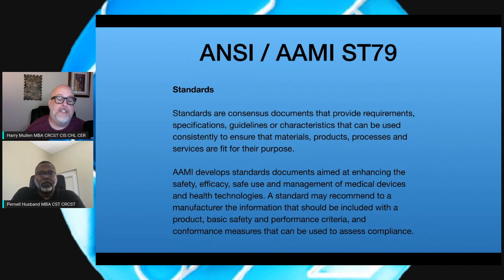Yeah. And as it says here also, AAMI develops standard documents that are aimed at enhancing the safety, the efficacy, safe use, and management of medical devices and health technologies. And we need to remember that a standard may recommend to a manufacturer the information that should be included with the product, things like basic safety and performance criteria, as well as conformance measures that can be used to assess compliance. So again, it goes back to the manufacturers stating that, if you really want our professionals to be able to understand and know how to effectively process or use your product, you need to set down in writing a certain way of explaining that.